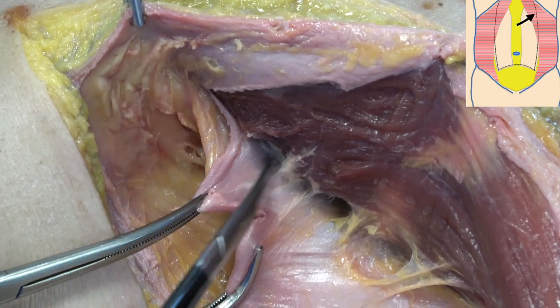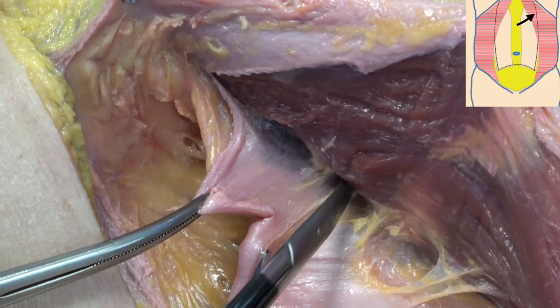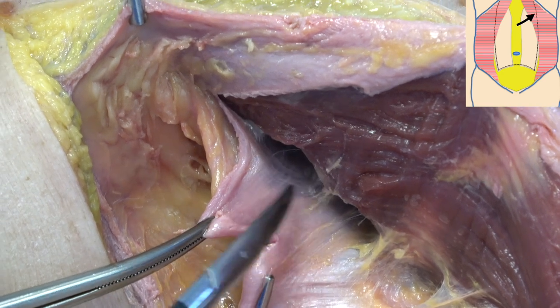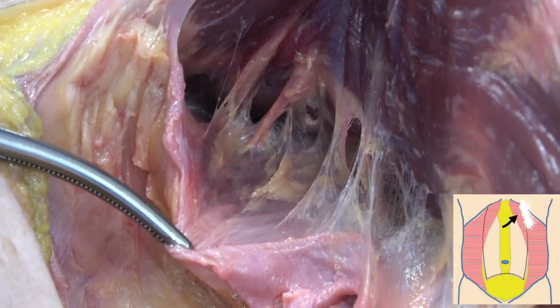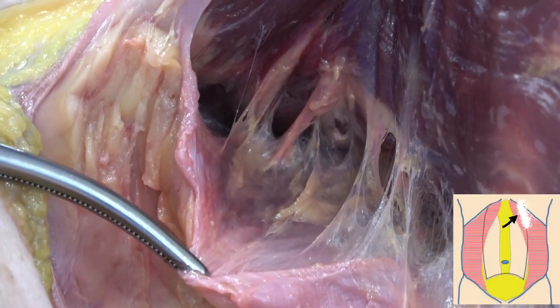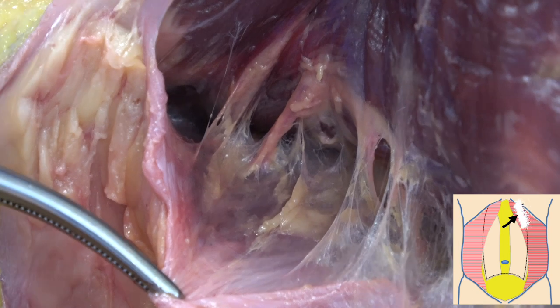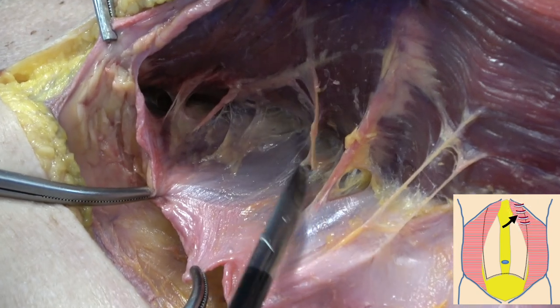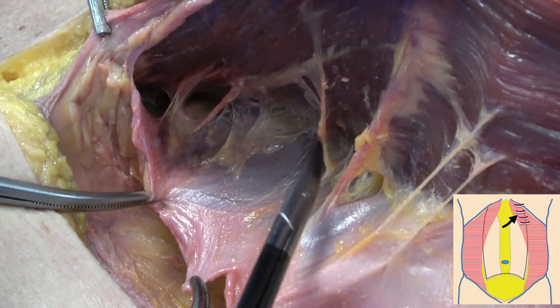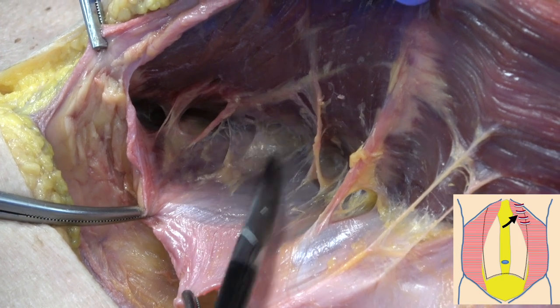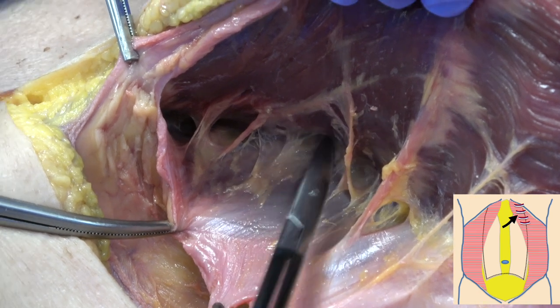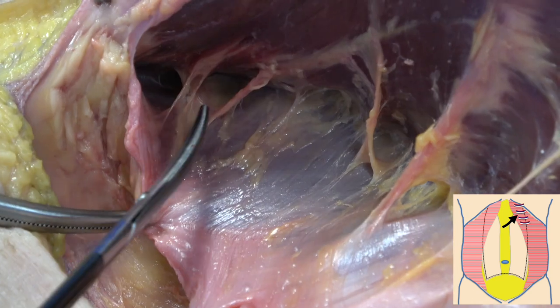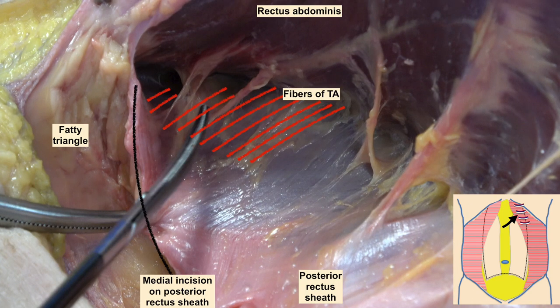Cranially, we stop the medial incision on the posterior rectus sheath about 6 cm below the xiphoid and do not dissect the retrorectus space at this area. We then identify the branches from the 7th to 9th intercostal nerves that run very medially near the transversus abdominis muscle.